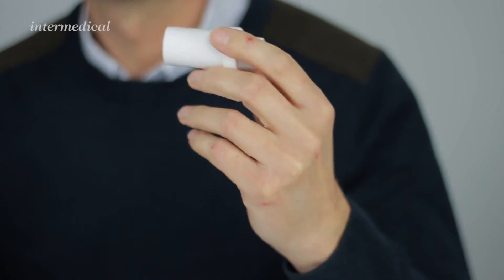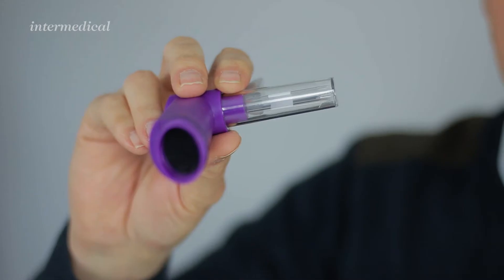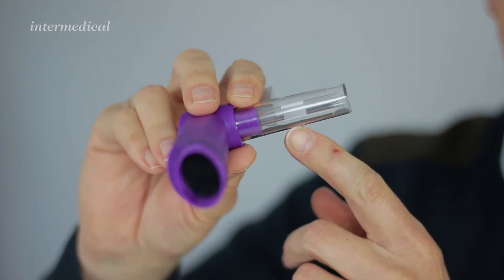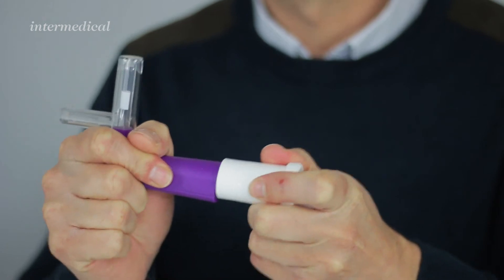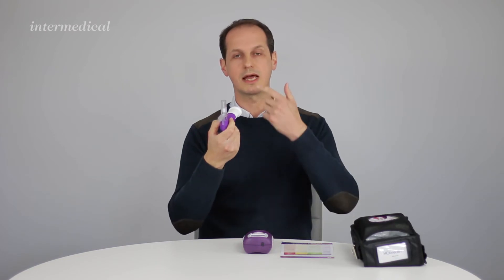The mouthpiece is single patient use and fits onto the flow indicator. In the flow indicator there's a ball, and when you blow in, the idea is to keep the ball within the white area to get the optimum flow from the patient. The mouthpiece pushes onto the front, and you can give this to the patient to practice with so they can understand the correct flow to blow into the device at.